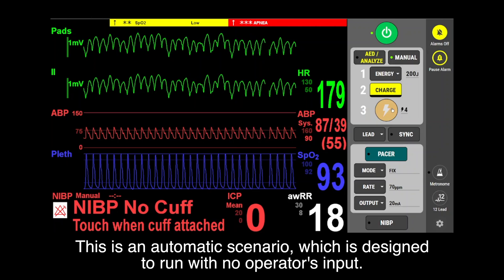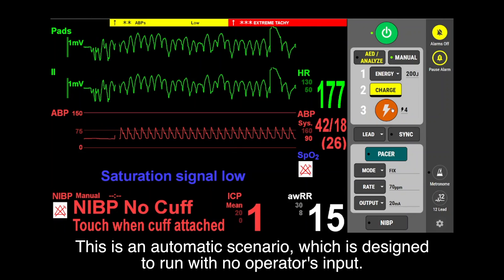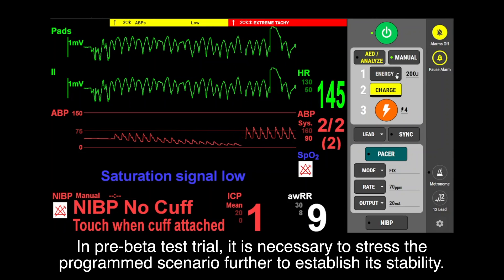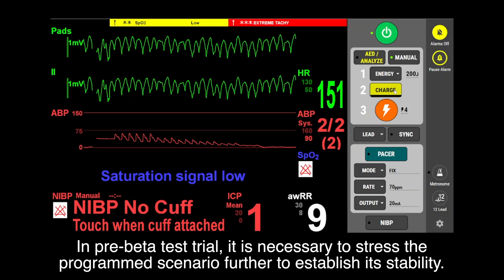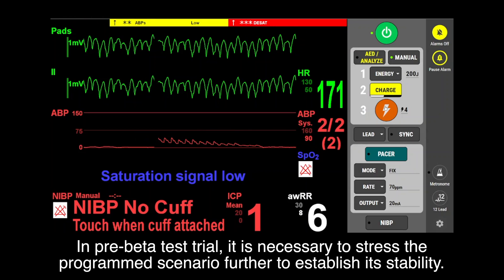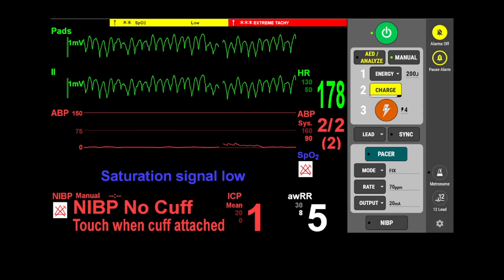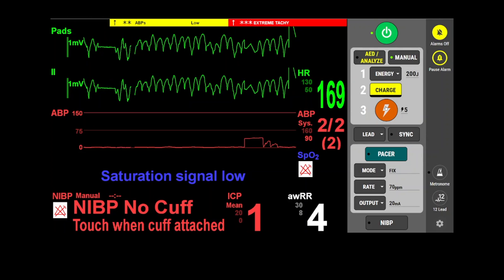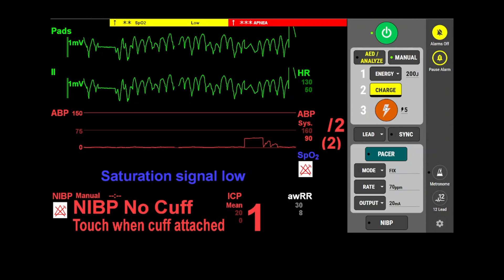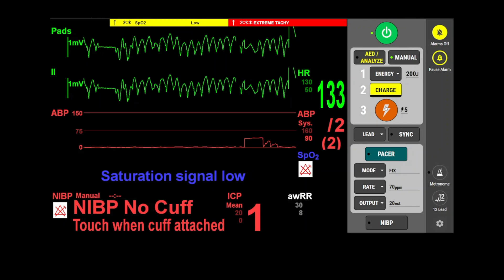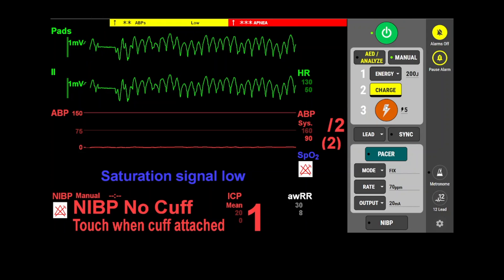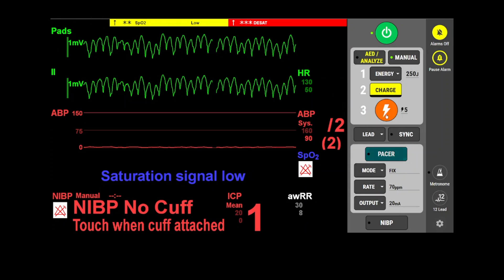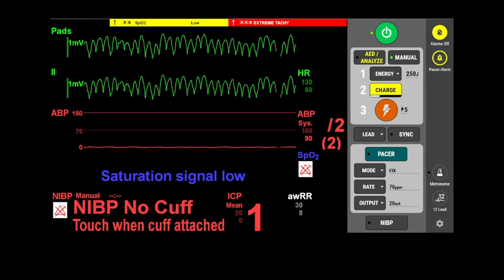ECG rhythm returns to wide complex tachycardia with pulse — ventricular tachycardia with pulse. In this pre-beta test trial, it is necessary to stress the programmed scenario further to establish its stability.